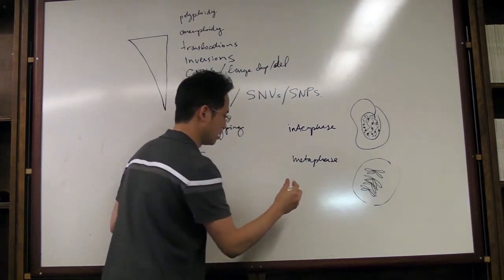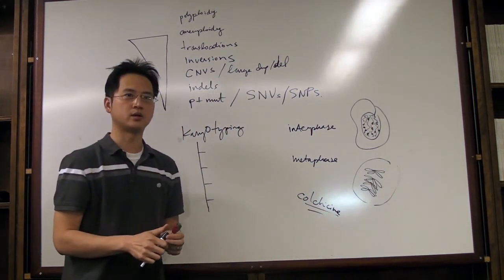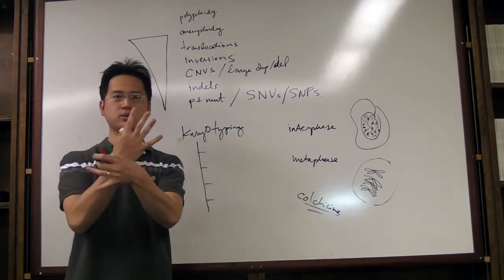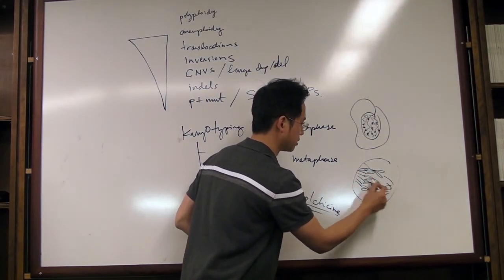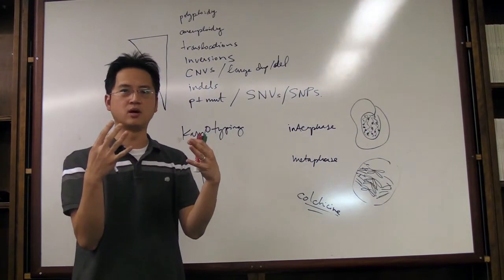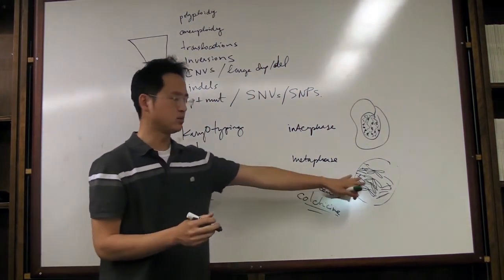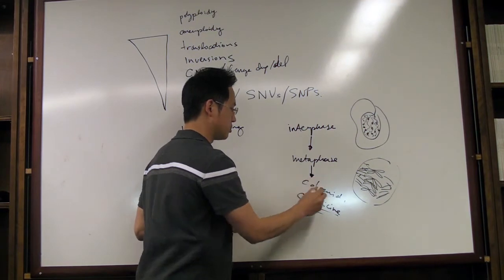So this is achieved by using colchicine. You guys remember where this might be from or what it does? It's a drug, it's a microtubule inhibitor, and it's commonly used to treat gout. And the way it does it is it just kind of locks microtubules in place. So here, there will be microtubules, they're structures. The centrioles, right, and the microtubules kind of organizing at the metaphase level. It basically locks all this in place and just freezes the cell in time so that it's stuck in metaphase. An alternative is colcemid, which is essentially the same thing, a microtubule inhibitor that will force it to be frozen in space. So you coax it to divide. You arrest it in metaphase with these reagents.